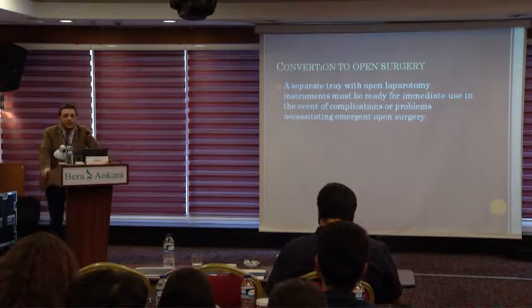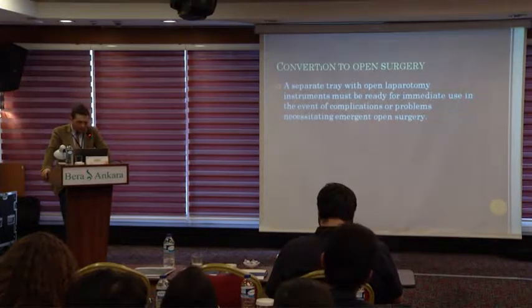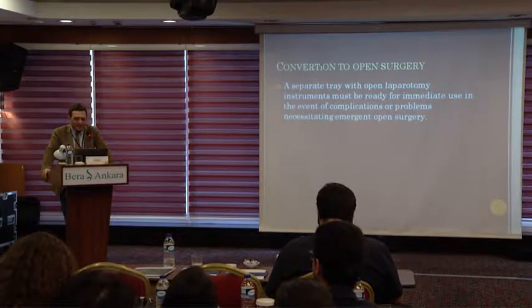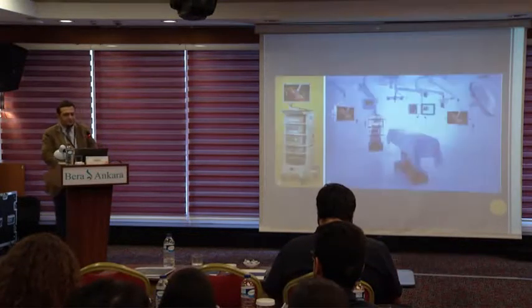Our textbook, Campbell, advises being ready for a conversion to open surgery for each laparoscopic case. So a separate tray with open laparotomy instruments must be ready for immediate use.